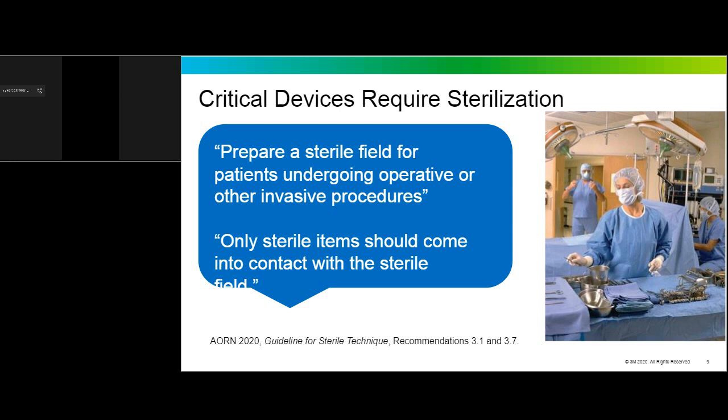And AORN reminds us we're setting up a sterile field for each procedure that's invasive, and critical devices that are used should be sterilized between patients. So in your clinic, as you prepare sterile fields for patient procedures, remember that AORN's guideline for sterile technique states that only sterile items should come into contact with that sterile field.